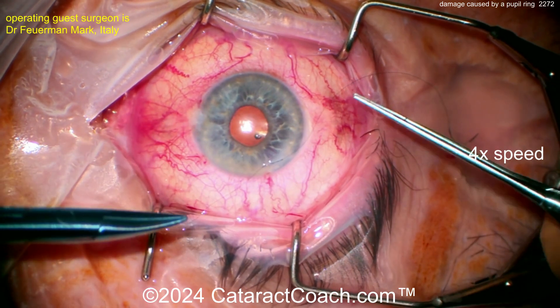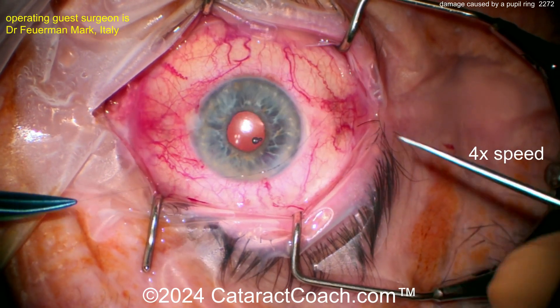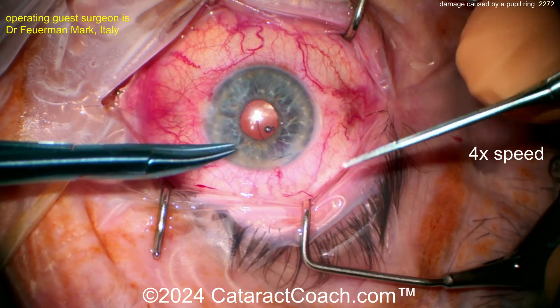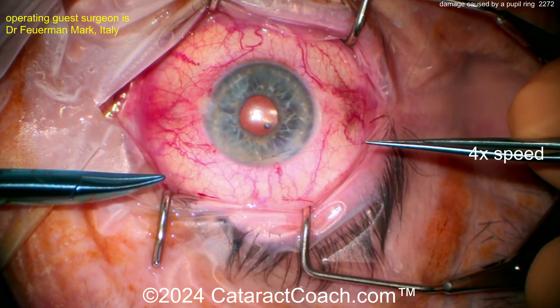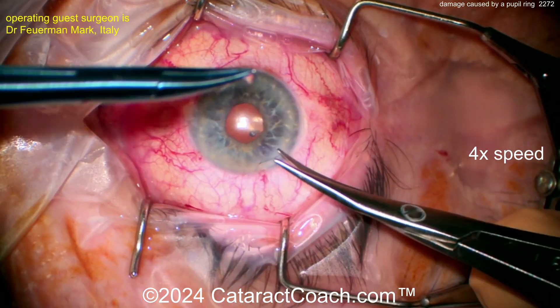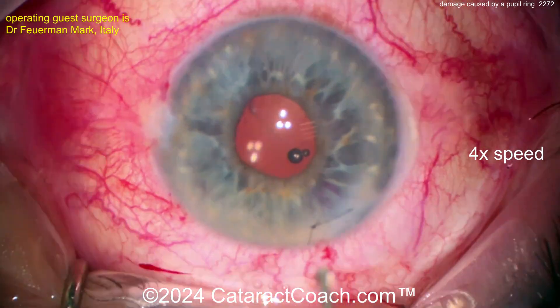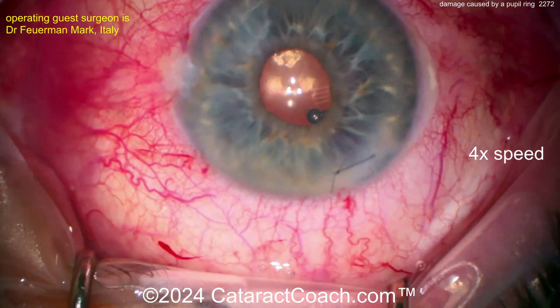When in doubt, just put the suture. If you put the suture at the time of surgery, it's not a complication. But if you see the patient post-op day one and the incision's leaking, and they go back to the OR to put a suture in — yeah, that's a complication. Benjamin Franklin said it: a stitch in time saves nine. Meaning, if you think you need a suture, you need a suture. Just accept reality. Now get that suture in good position and get it rotated around.